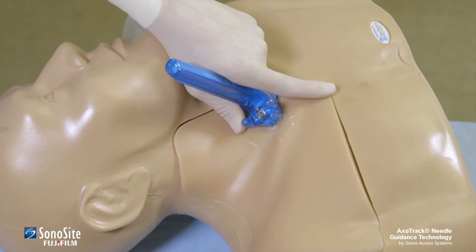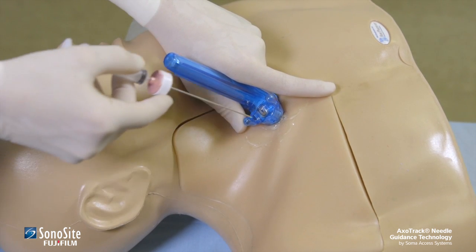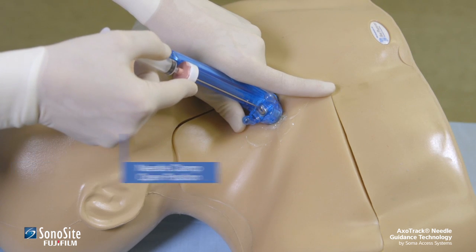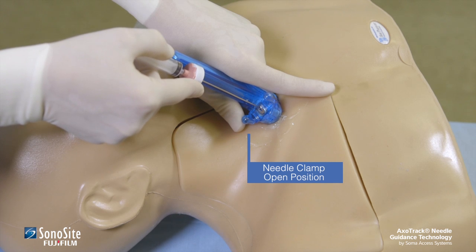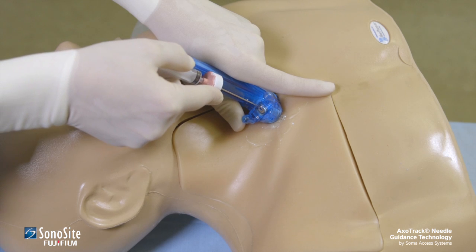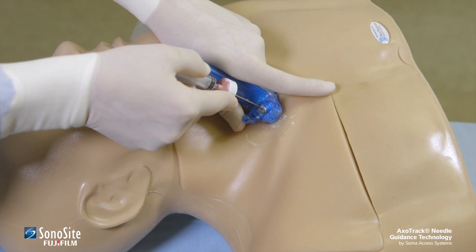Once the anatomic target is located and aligned with the target line, the practitioner places the prepared needle in the needle guide. The needle clamp must be in the open position or the needle guide will be occluded, preventing the needle's passage into the guide. The needle can then be advanced in a controlled, deliberate manner to the target. Do not apply pressure to the needle clamp during advancement of the needle through tissue because excessive force will be required to advance the needle.